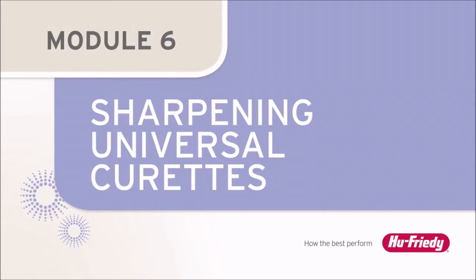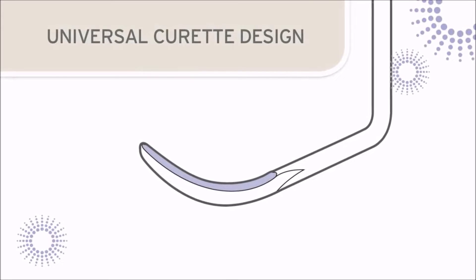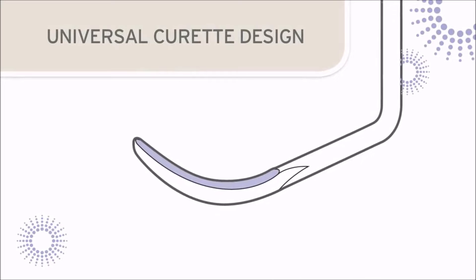Sharpening Universal Curettes. Universal Curettes such as Langer, Columbia, and Barnhart Curettes have two parallel cutting edges.